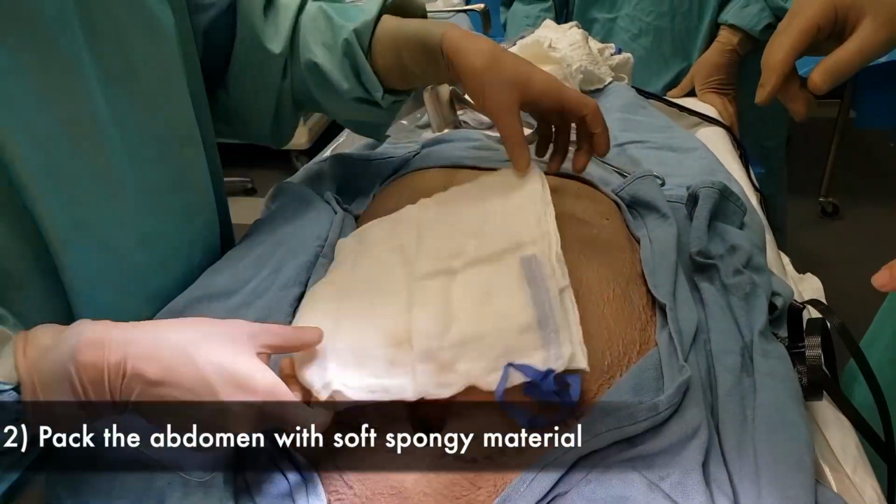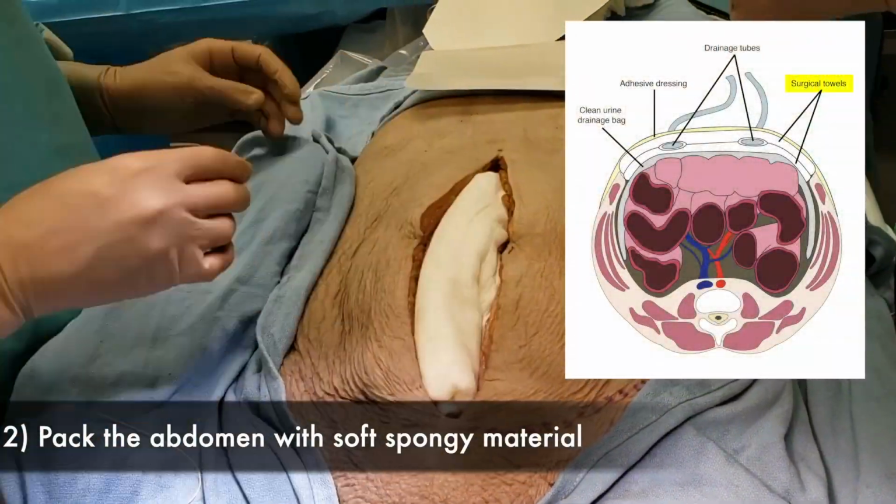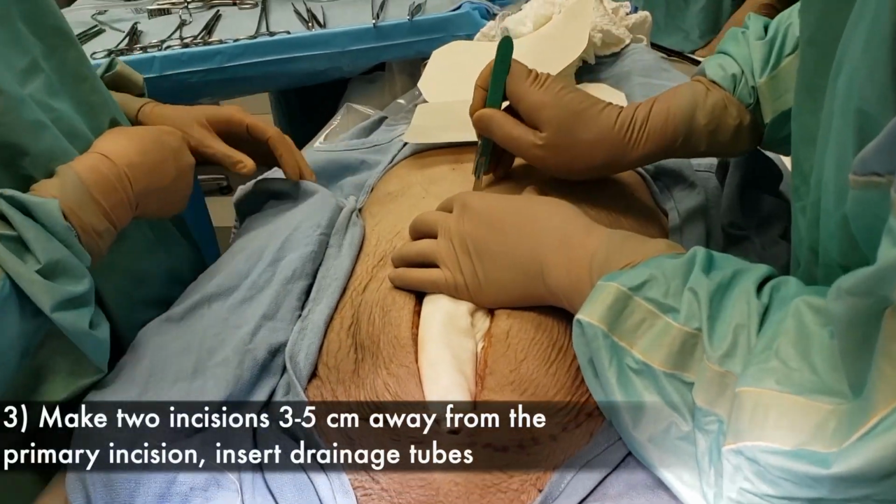Next, pack the open abdomen with a soft spongy material. In this video, a surgical towel was used. The drainage system will now be created.